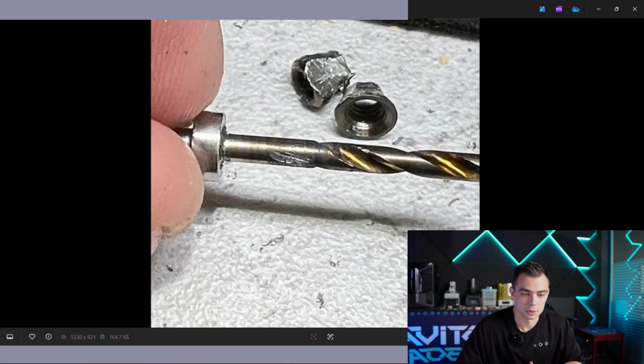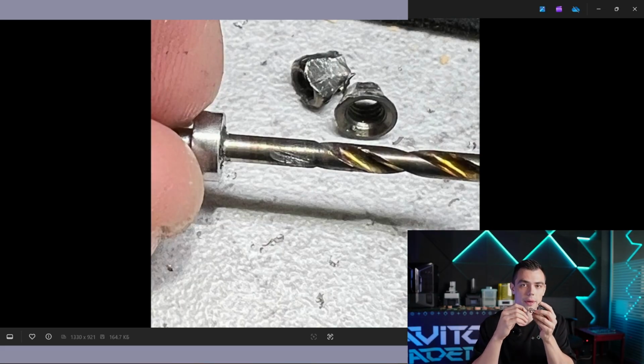Another thing I would like to tell myself when I was starting making surgical guides: please, Nikita, double check everything. When you make surgical guides, it's not only about modeling them, but also about post-fabricating them, because you make real items which you can touch, and you can check them with the drills. Always, before the surgery, check the drills and check the sleeves, and please have test drills for each type of surgical guide kit.